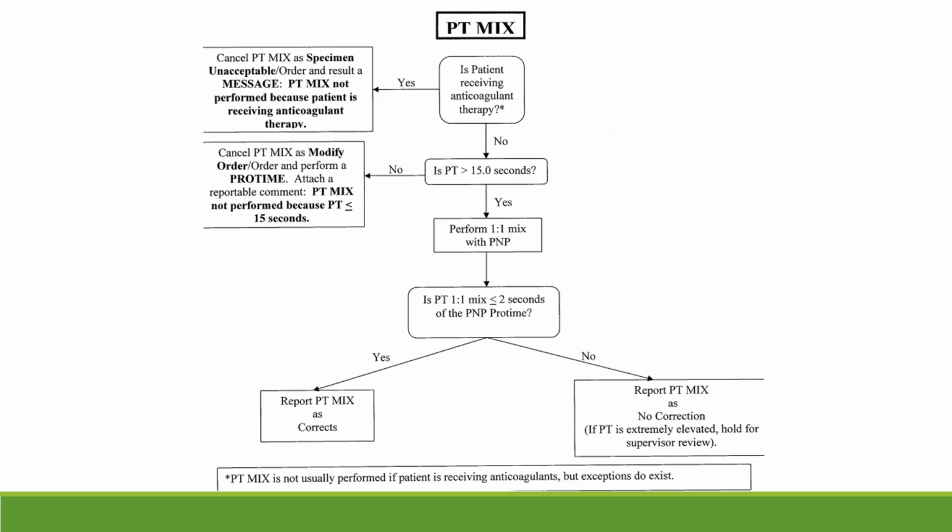If the PT is extremely elevated, we're going to hold it for supervisor review anyway, just to make sure that there's no instrumentation problems, or make sure that we've done everything that we can do to get valid results on this. And it might be that the patient really is on anticoagulants that we don't know about. So it's important to know what's going on with our patients.